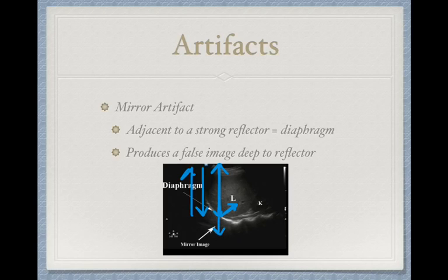So it basically puts the liver tissue image posterior to that diaphragm. And the reason that that's so important for this right upper quadrant image is because when there is no fluid up in the pleural space, you're going to get that mirror image.